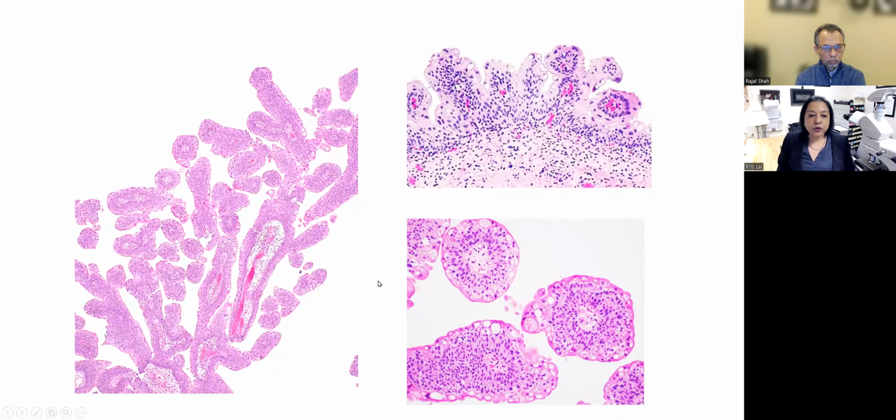So this picture I put in here to remind you that the umbrella cell layer of papilloma can be very, very prominent. And as you know, umbrella cells can have very basophilic nuclei. They can have very pleomorphic or atypical looking nuclei. They can have binucleation, etc. And these features are a little bit disconcerting, but eventually, if you recognize them as such, they become easy to recognize as benign nuclei.